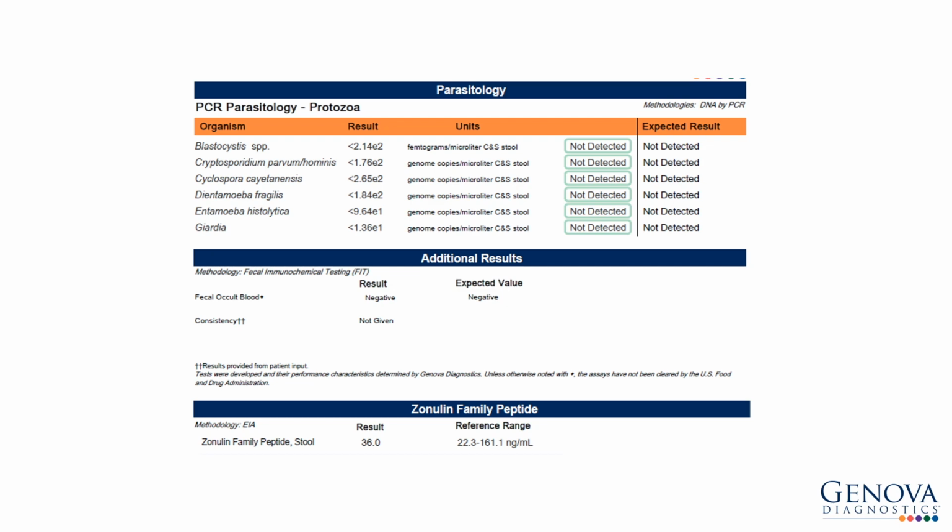These were not added on to this report because the diarrhea is chronic, it's not profuse, and it's not bloody. Lactoferrin is another add-on marker of neutrophil-mediated inflammation, but was not added on here. We do already have the calprotectin, which is a marker for neutrophil-mediated inflammation, and we did see that was elevated with this patient.